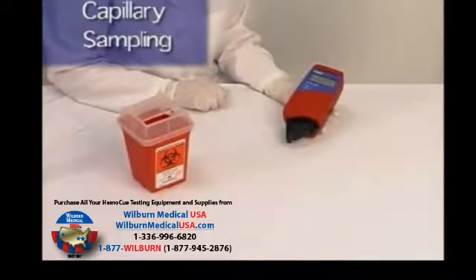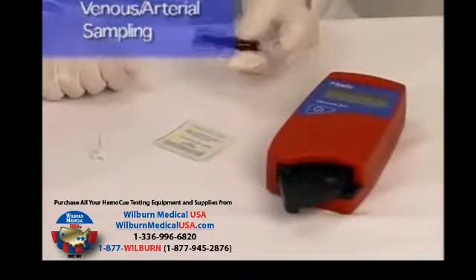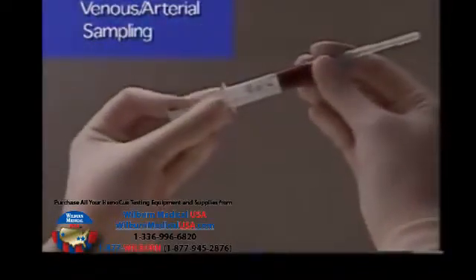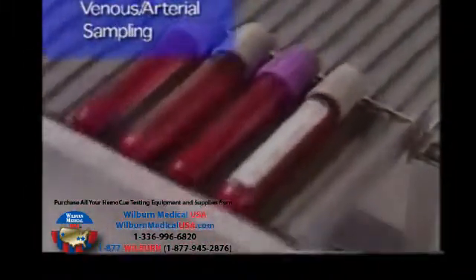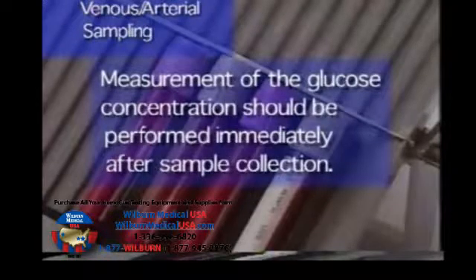In case of severe hypotension or peripheral circulatory failure, glucose measurement from a capillary sample may be misleading. In such circumstances, it is recommended that venous or arterial whole blood be used. Capillary, venous, or arterial whole blood may be used. Appropriate anticoagulants in solid form such as EDTA, heparin, or heparin fluoride, and glycolysis inhibitors such as sodium oxalate, sodium fluoride, and potassium oxalate may be used. Glycolysis is a major concern in all glucose measurements. To minimize the effect of glycolysis, measure the blood sample as soon as possible after taking the sample.